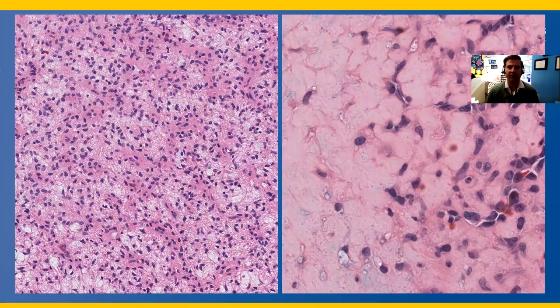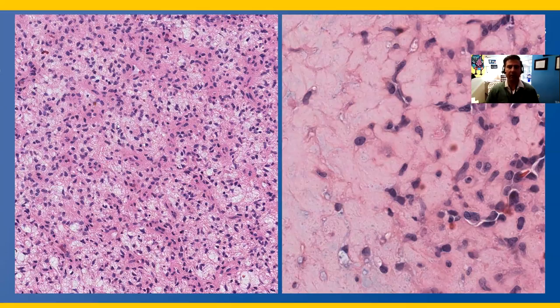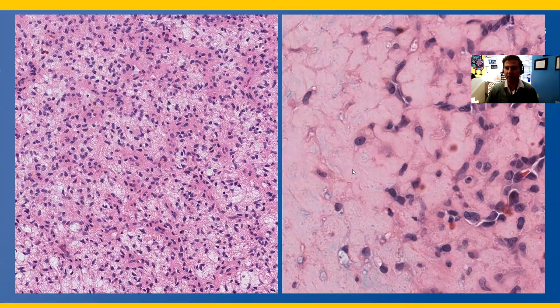At higher power, these cells are quite bland — spindle to ovoid, somewhat polyhedral in shape. This pattern here is a micro-lobular pattern, with smaller lobules compared to the macro-lobular pattern seen before. No cytologic atypia is identified. On the right, we confirm bland, polyhedral to spindle, somewhat stellate-shaped cells in a background chondromyxoid stroma.